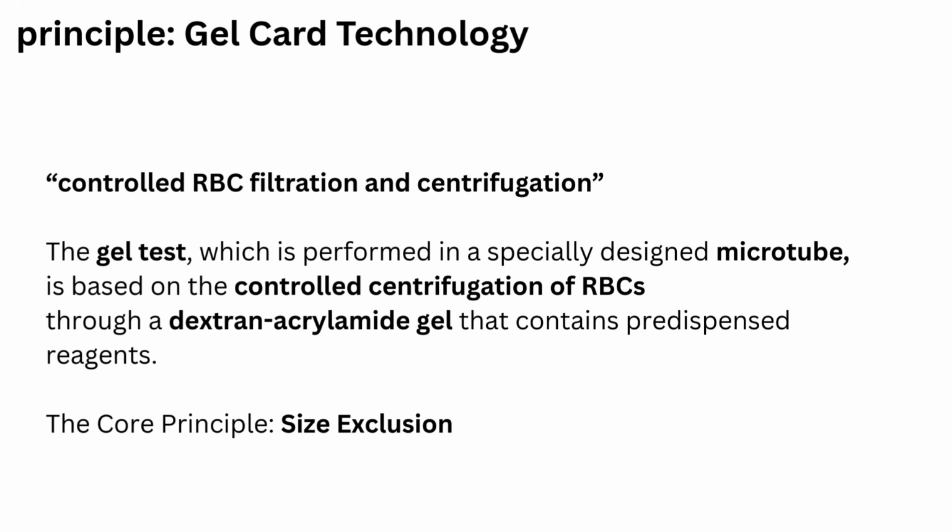The key principle here is size exclusion. So again, the principle, controlled RBC filtration and centrifugation, and the very core is size exclusion. As RBCs move through the gel, their size determines their journey. Larger clusters might get trapped while smaller ones slip through. This innovative approach allows for precise and reliable testing outcomes.